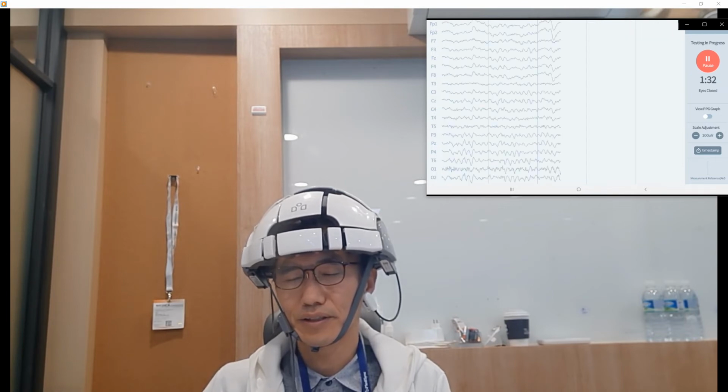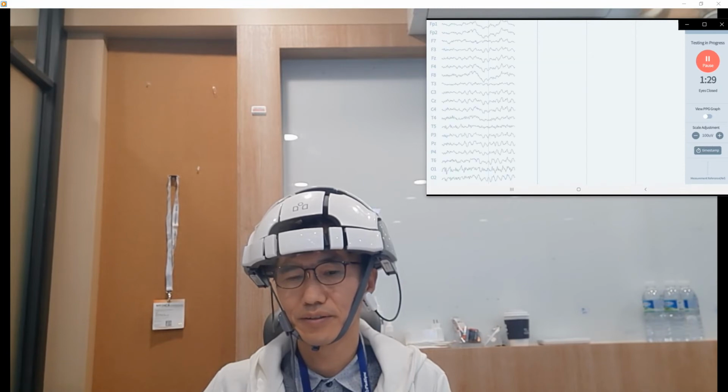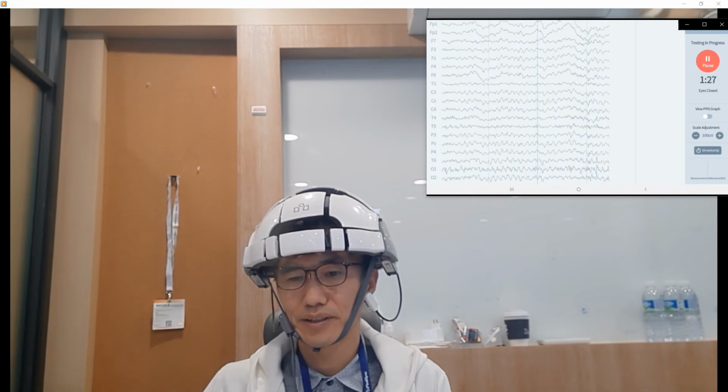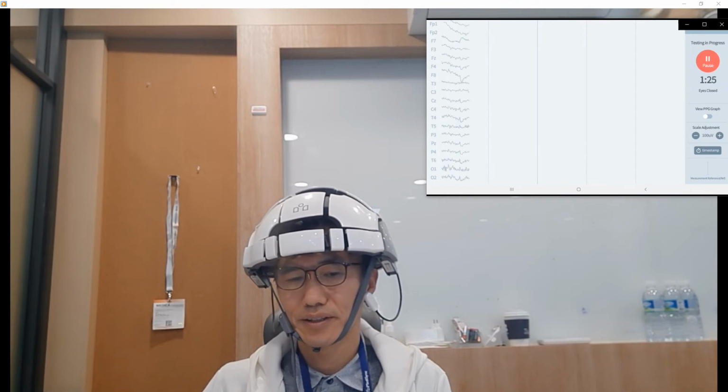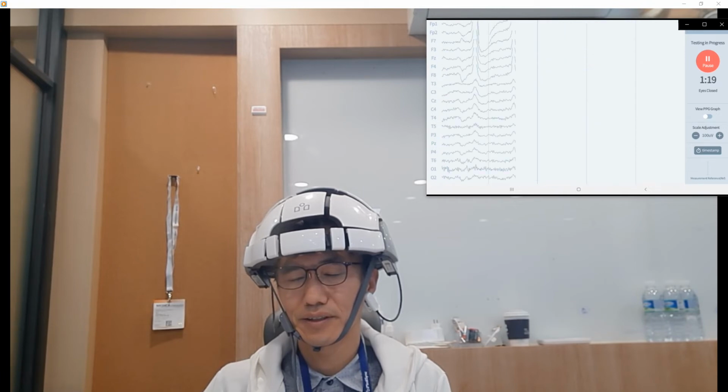If I open my eyes, the alpha activity is gone. Eye blinking starts. Eyes close again. You can find the alpha activity again.